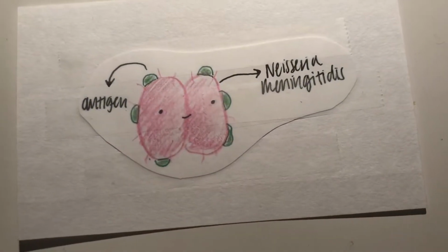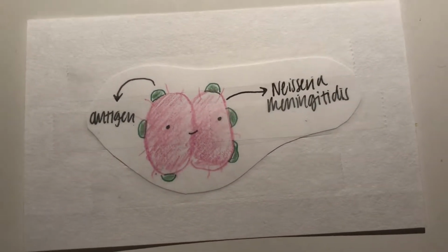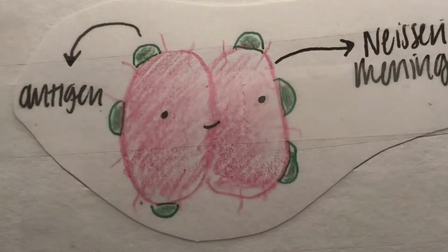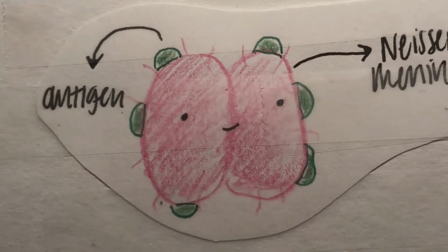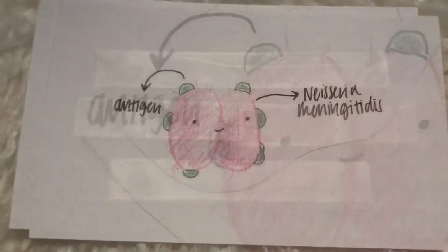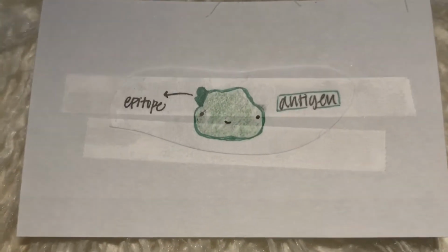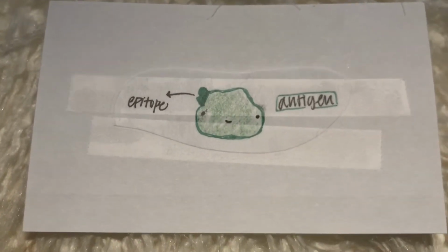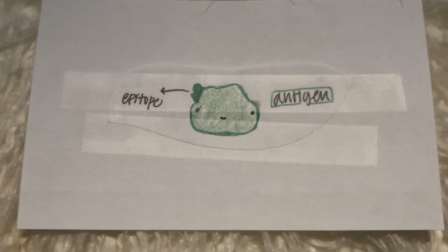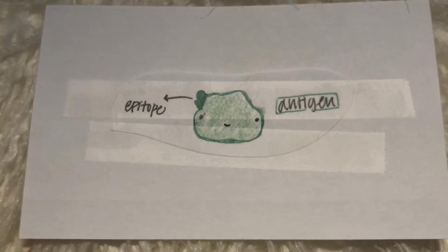Here we have a diagram of what Neisseria meningitidis looks like, and the little green dots on the surface of the membrane are known as the antigen. Now if we get a closer look at our antigen, this is what it should look like. Each specific antigen has an epitope.